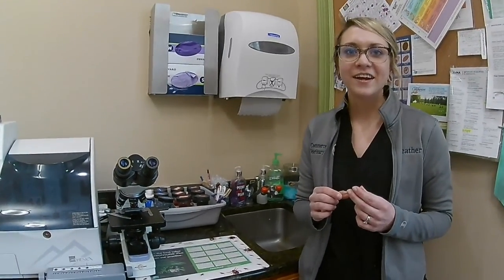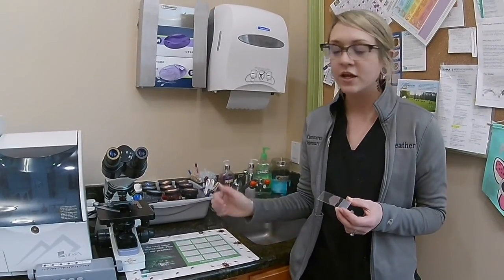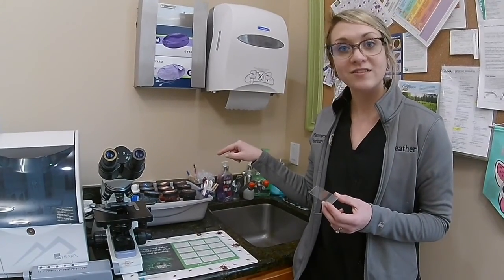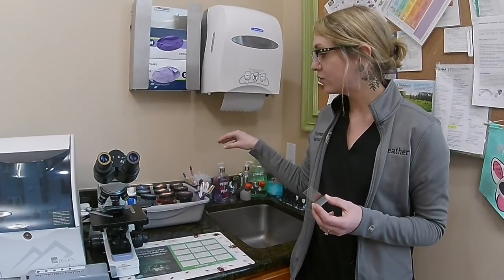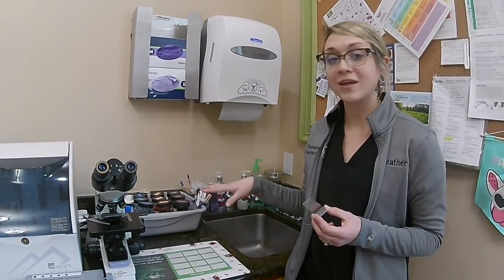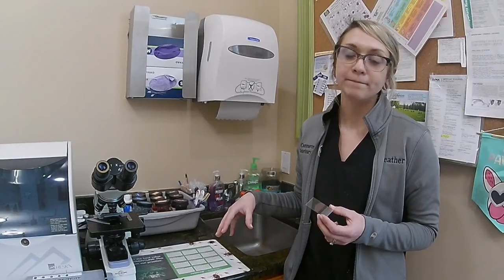Okay. All right, Heather Lieberman here again. So we're getting to the next portion of doing the stain. So we're going to do 3 different dippings, basically. The first one is a fixative. The second one is an eosin stain. So that one is going to be for the basic components of the cell, like hemoglobin. And then the third one is a blue one, which is methylene blue stain. And that is going to be the acidic components of the cell, like the white blood cell nuclei.